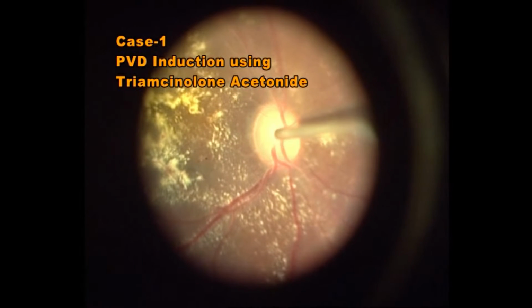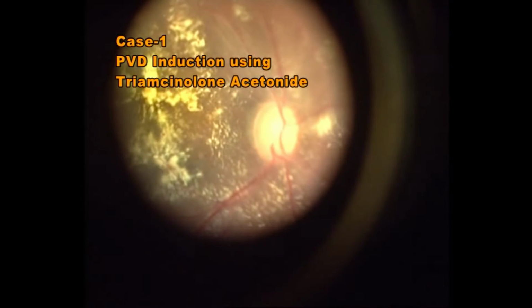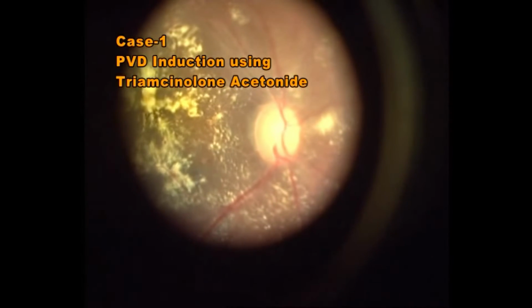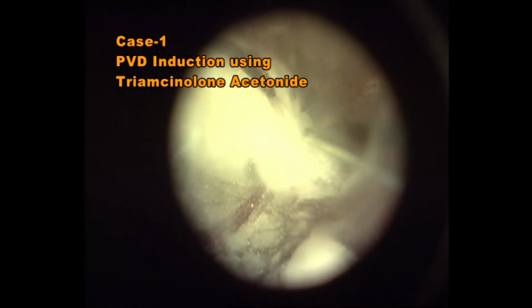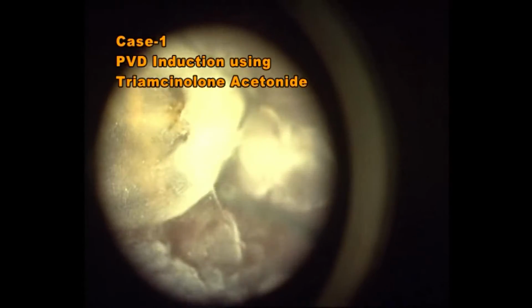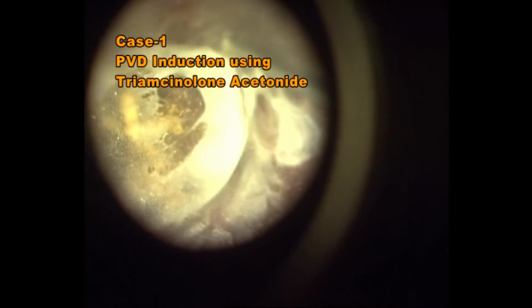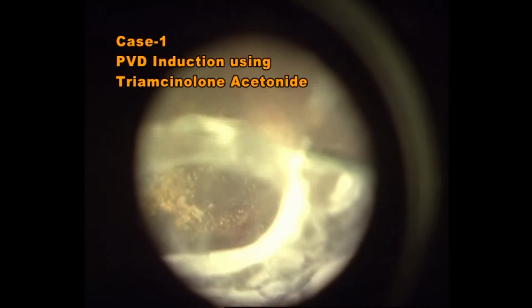The first video clip demonstrates posterior vitreous detachment induction in a patient with recalcitrant diabetic macular edema using active suction of a 23-gauge cutter. The posterior hyaloid face is delineated in this patient using triamcinolone acetonide crystals, a technique akin to cloaking a ghost. In this patient, the PVD induction occurs very easily.